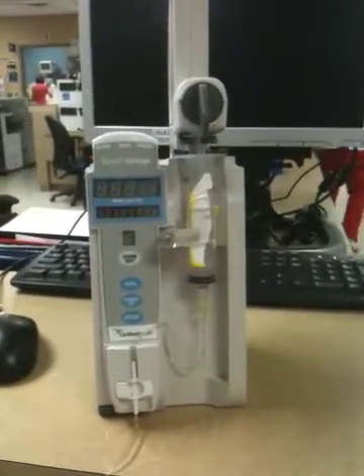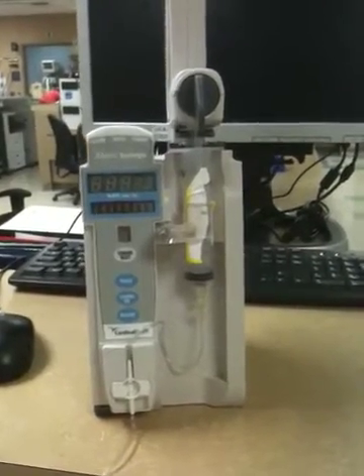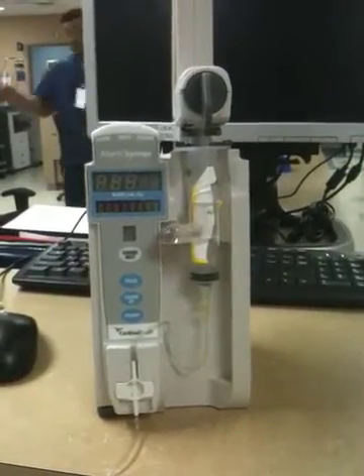This is a syringe pump. Syringe pumps work the same way as most other pumps do. However, they've got different tubing and you connect them in a different way.